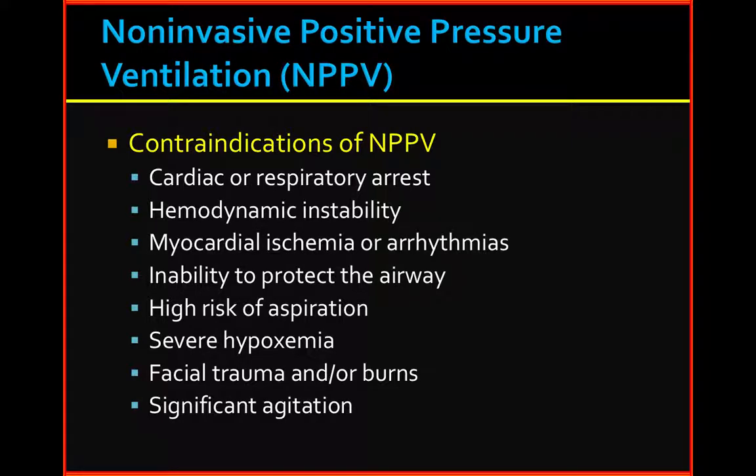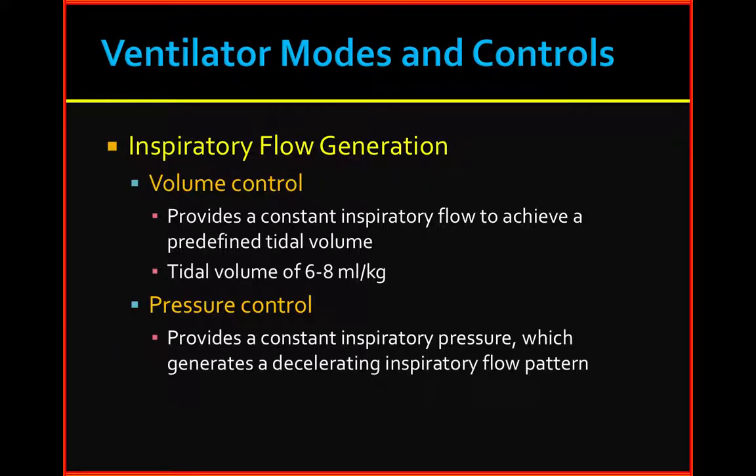So if you want to be a little more technical, if you're working in the ICU, this is what the respiratory therapist deals with: there's different components of the inspiratory flow generation, cycling, triggering, mode, PEEP. I've given you the information about all of it, but you don't need to know this, only if you're going into it. But the tidal volume is important. And this number 8 is the magic number that you've already seen that I want you to know.